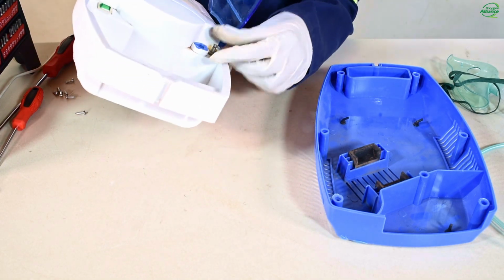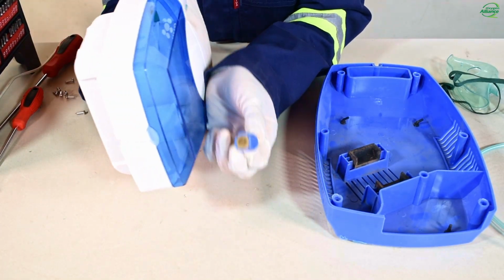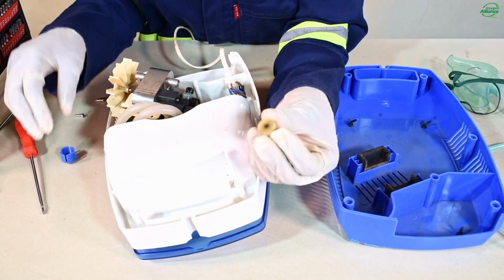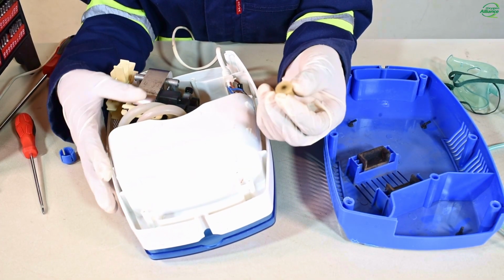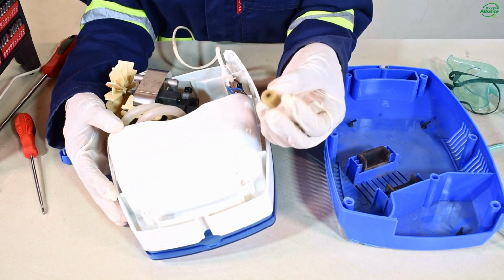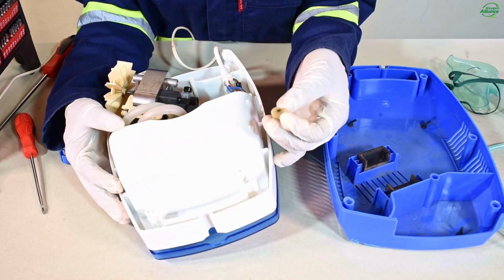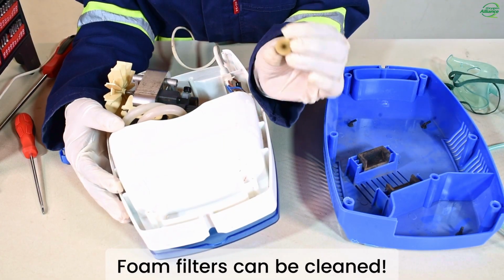Like I showed you earlier, this is the air filter. A dirty or clogged air filter restricts airflow to the compressor. This results in low or no pressure supplied to the nebulizer kit. With low pressure, there will be no mist production. If the filter is dirty, it is recommended that it should be replaced. However, depending on the type of filter, you may just clean it. For example, with this filter.